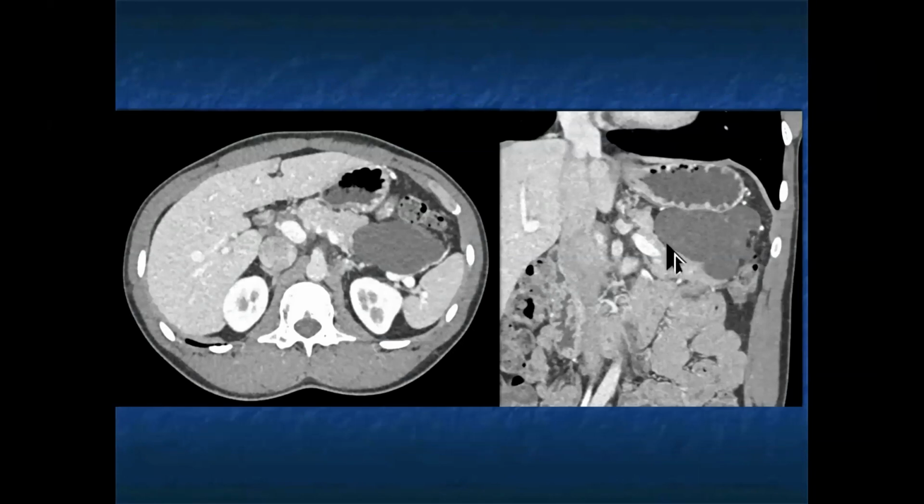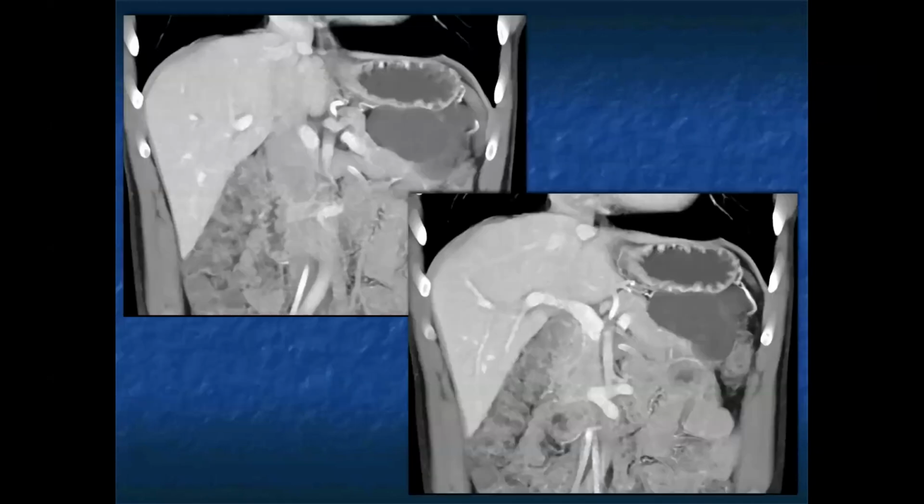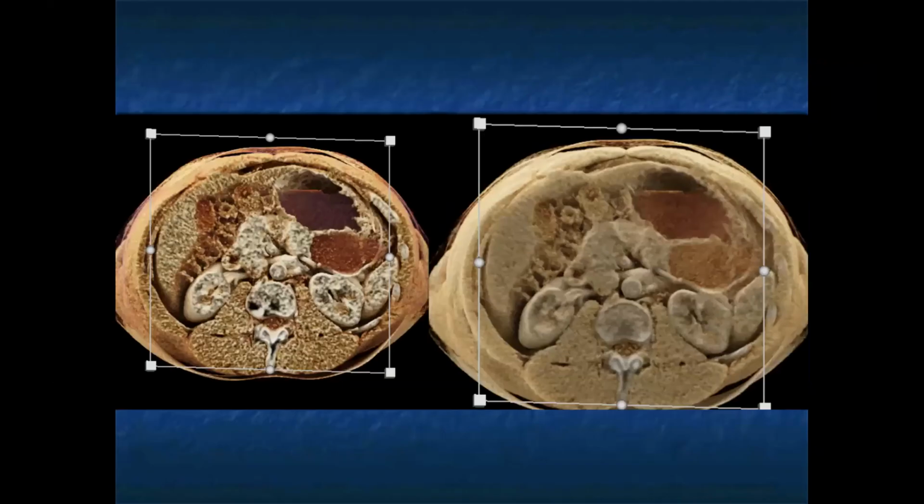When I see a lesion that scallops the gland, I'm saying lymphoepithelial cyst, okay? Then you won't biopsy it. They will eventually operate and just resect it when it gets large like this. But it's that scalloped appearance, it's that exophytic nature that allows you to make the diagnosis. So that becomes very important. You can see it here on the cinematic.